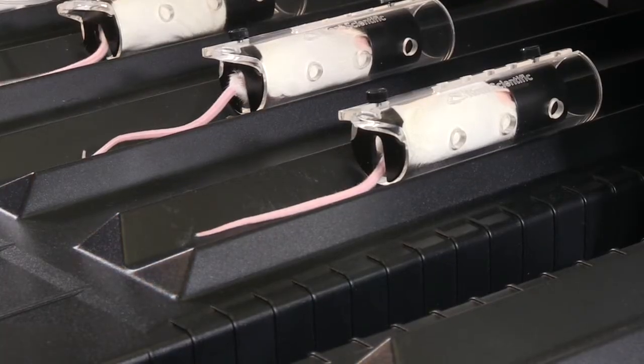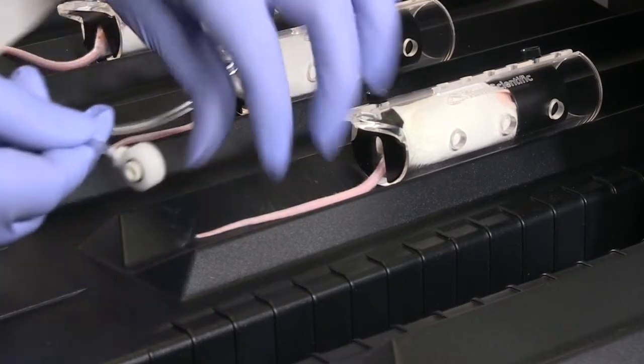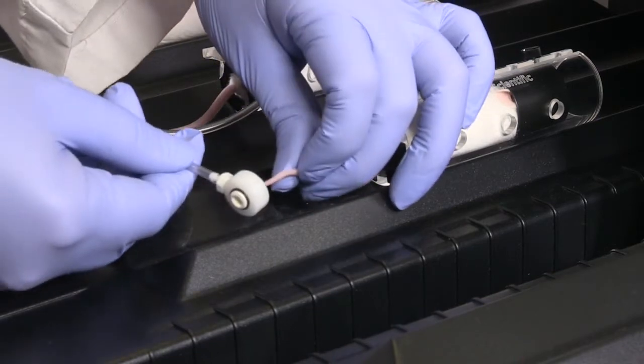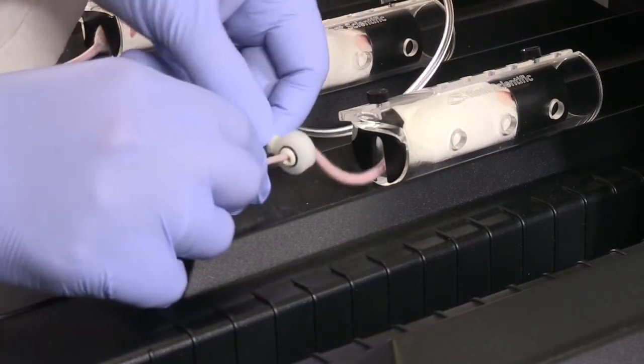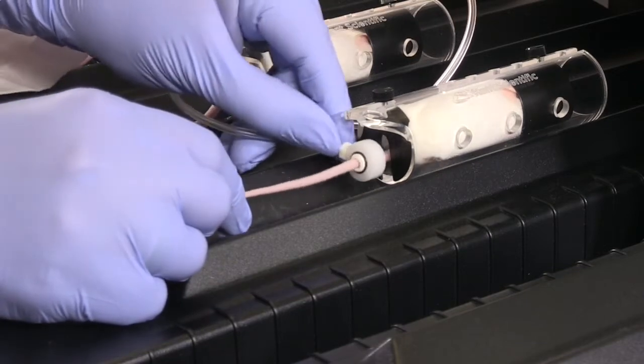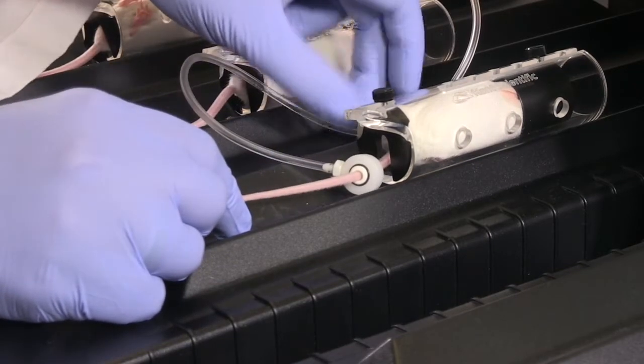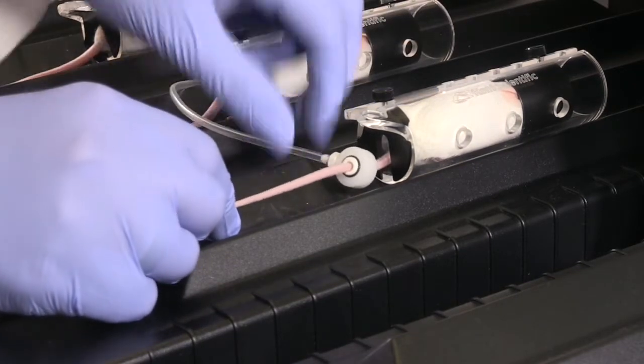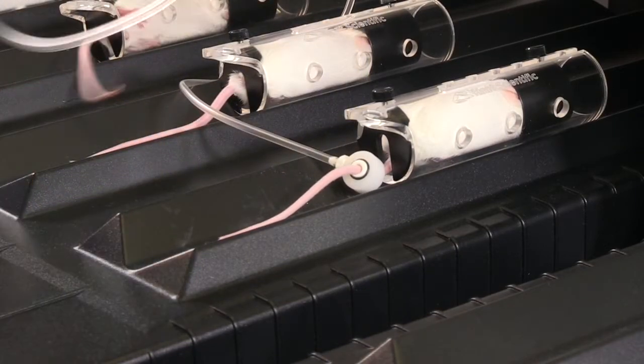Proper cuff placement is very important for accurate blood pressure readings. First, slide the occlusion cuff up the tail, just until you begin to feel some friction. The cuff should fit closely to the tail but should not be tight. The cuff doesn't need to reach the base of the tail; fit is more important than position.